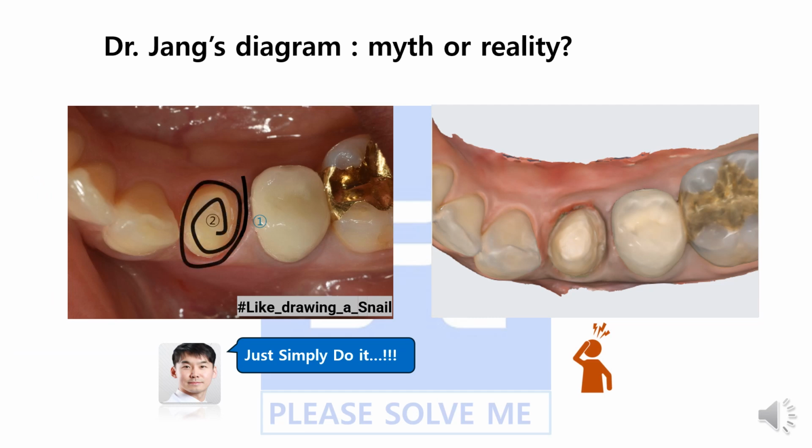This is a sketch I draw for my staff showing the sequence, and I'd like to share it with you. When I draw this path, I never lift my pen once. It is drawn in one continuous line. In the same way, the entire part of the prepared crown could be obtained with a single uninterrupted motion.